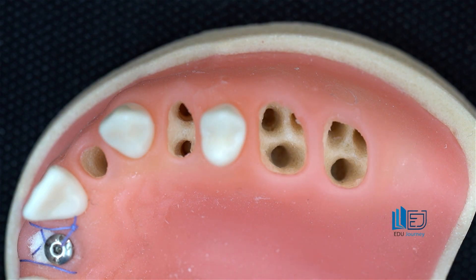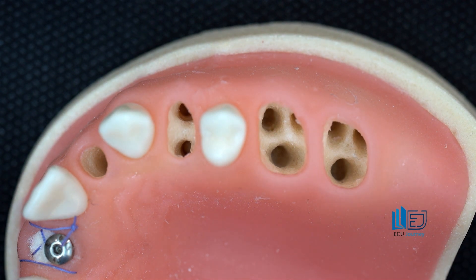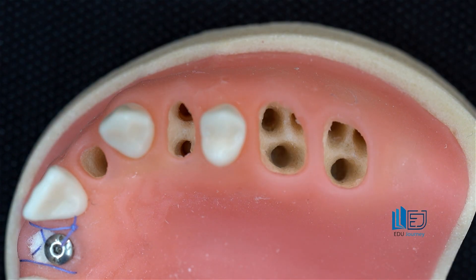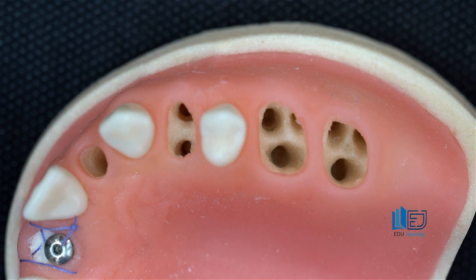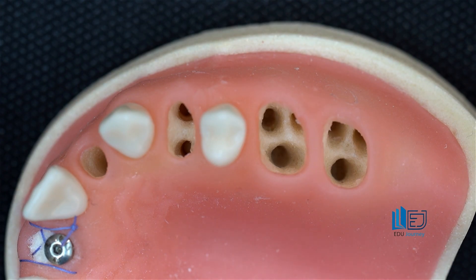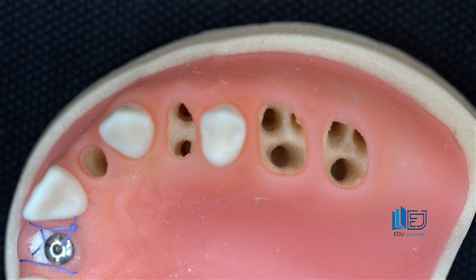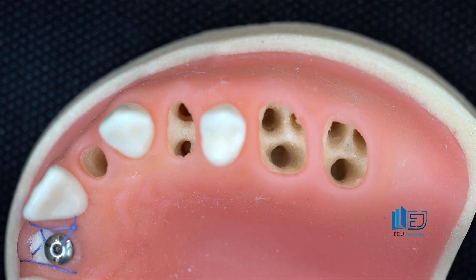Therefore, fresh socket implantation in the molar area means the remaining molar tooth must be extracted by sectioning the roots. The roots need to be removed one by one to ensure that the maximum amount of periodontium around the tooth is preserved. Even in the premolar area, this sectioning can be performed — for the upper fourth tooth, we can section it and remove the buccal and palatal roots separately. This is about less traumatic extraction and maximum preservation of bone and soft tissue around the tooth where we want to perform fresh socket implantation in the posterior areas.